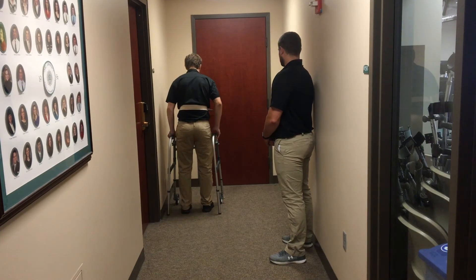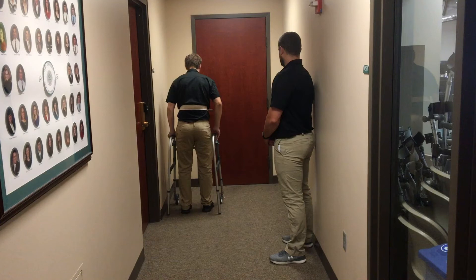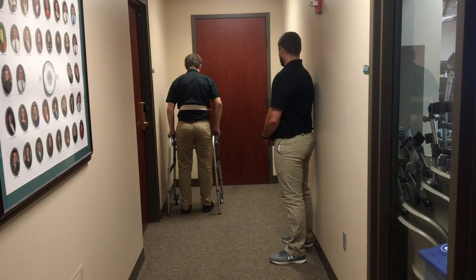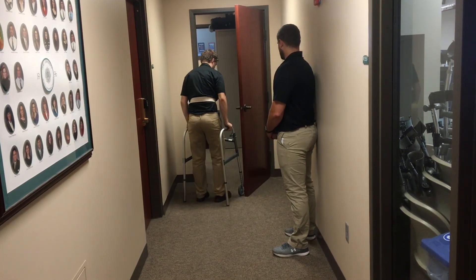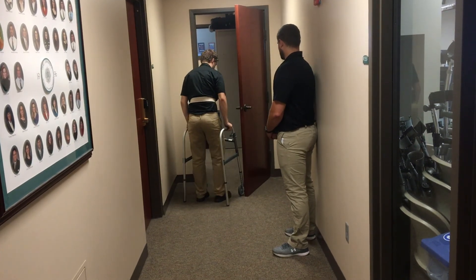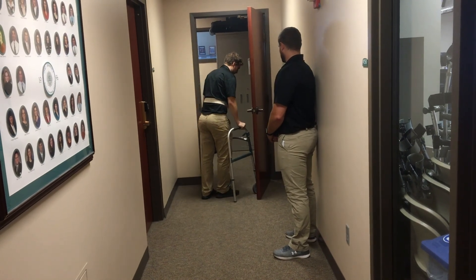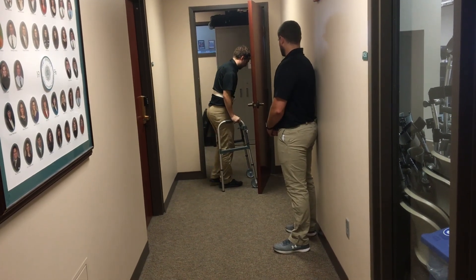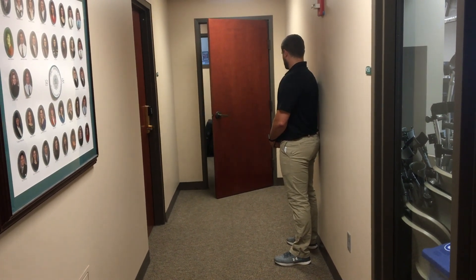Instruct the patient to approach the door as before on the handle side of the door, outside of the door's swing arc. The patient will then shift their weight to the hand opposite of the door handle and use the unweighted hand to swing the door wider than the walker and the patient. The patient will then quickly return their hand to the walker and move the walker into the open door with the legs closest to the door serving as doorstops. The patient will then step into the walker and turn the walker sideways into the doorway. The patient can push the door further open if needed, then slowly ambulate sideways through the doorway using the legs as doorstops until the patient is completely through the door.